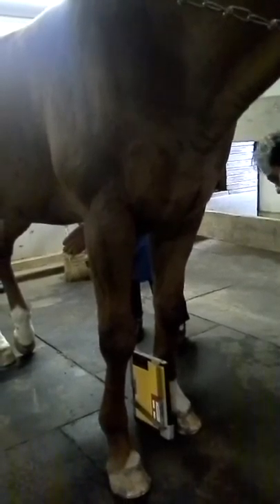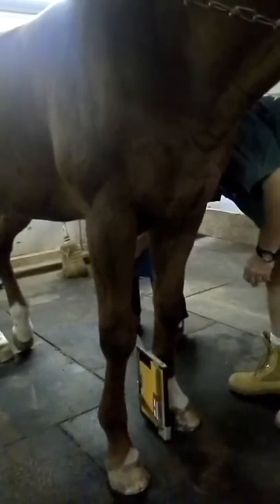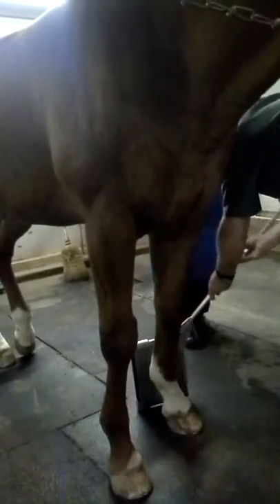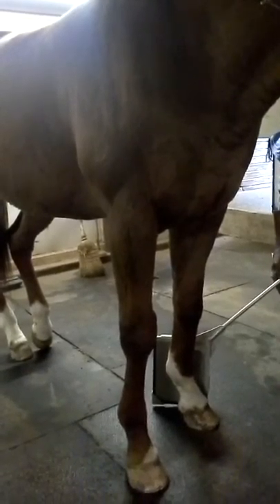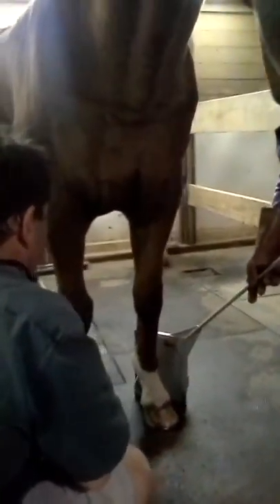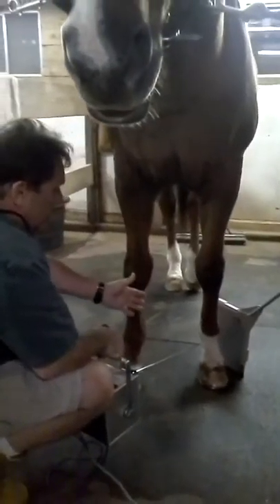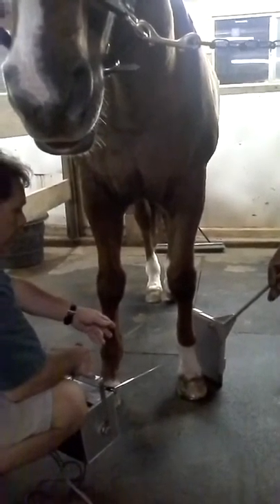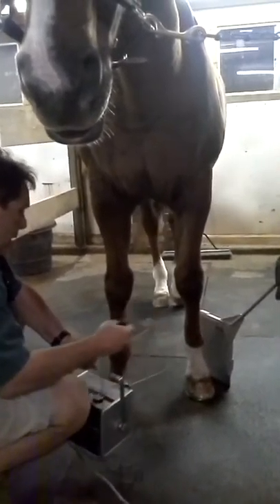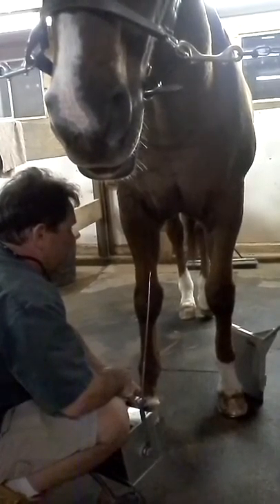The next view you would take would be the medial oblique, which would be turning around this way, positioning in this position. You're taking a medial oblique, which means you're coming from this direction so that you can highlight the different sesamoids — specifically the medial sesamoids and all the anatomy on the medial side of the bone, of the leg. You take it from this side, put your pointer up, and take the picture.